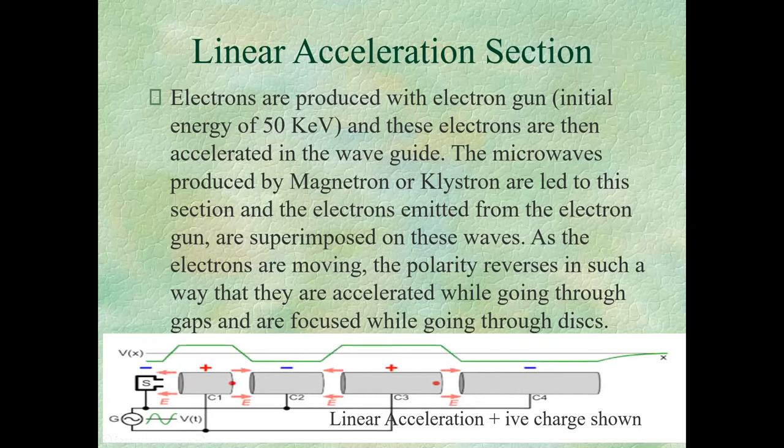It has a conical hole for the beam to pass through. It sets the maximum field size and minimizes the scattered radiation that is escaping the machine. So we don't have a lot going on here. We are just confining the beam to move it to our next step. This is made of a tungsten block. Then once they go through the primary collimators, they move to the next step.